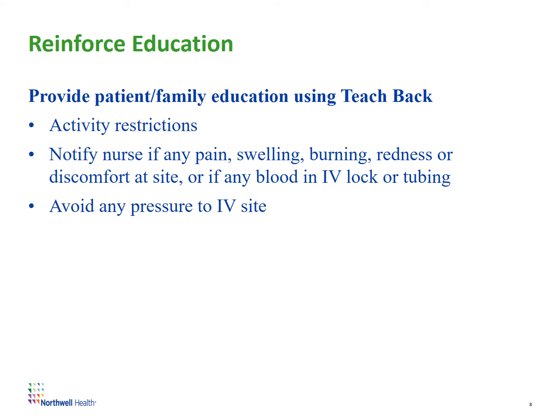You always have to reinforce with the patients and their families the maintenance of the IV that is inserted, and reporting any unusual side effects or complications, and activity restrictions. And we always use teach-back methodology to inform and educate patients and families.